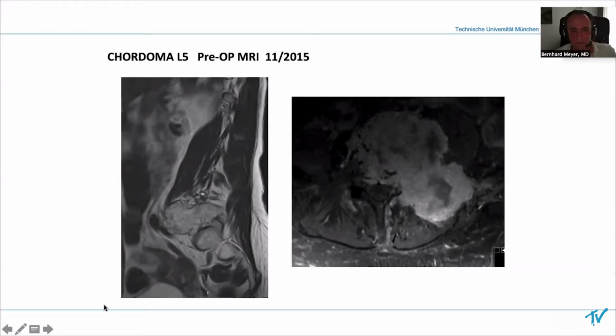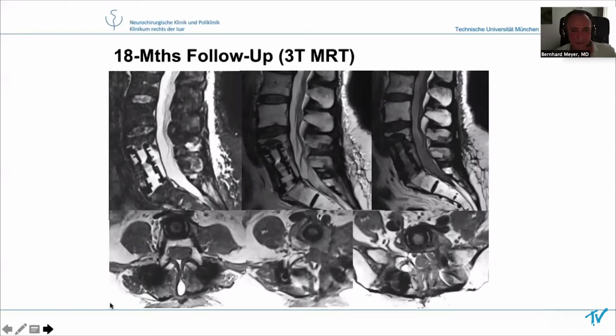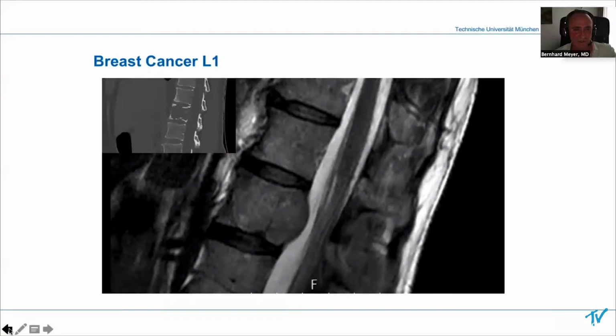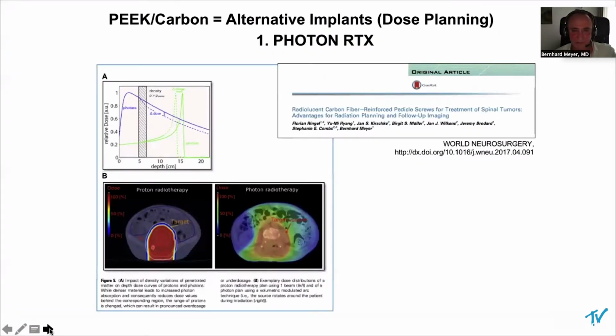This is one of them, a typical example of a chordoma, unfit for en bloc resection, but fit for complete resection, which we did in that instance that way. And here you can see an 18-month follow-up. And I think you can clearly appreciate how well you can see that there is no residual tumor, there's no recurrent tumor, and this patient is now 3 years down the line, and he had a recurrence seeding along the retroperitoneal approach, which you could see and take out, and then again do proton beam therapy.